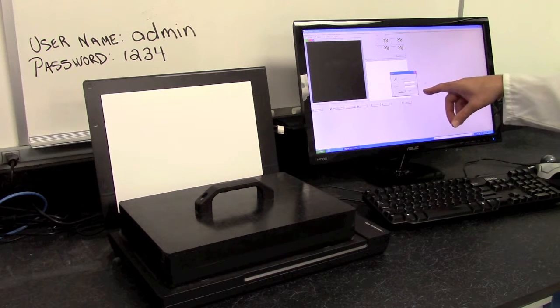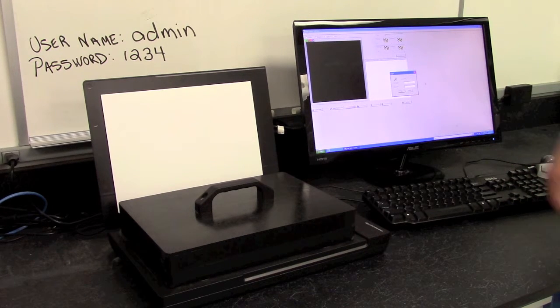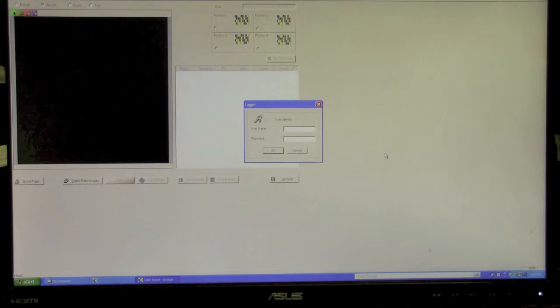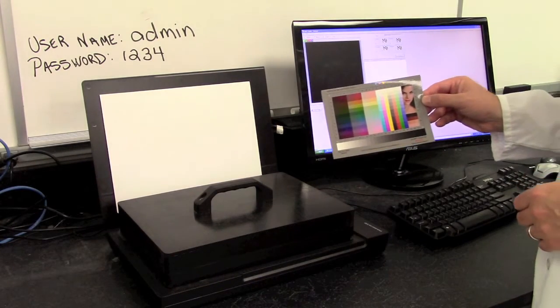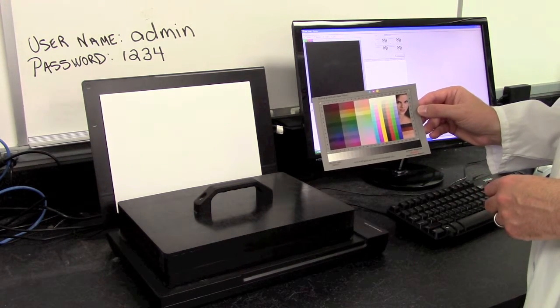So the username and password is in the operator manual, and it can be changed by the operator once you've launched the software. The username is the word admin, A-D-M-I-N, and the password is 1234. Once you've logged in, the first thing you're going to do is take the calibration card and calibrate the scanner based on this color spectrum.